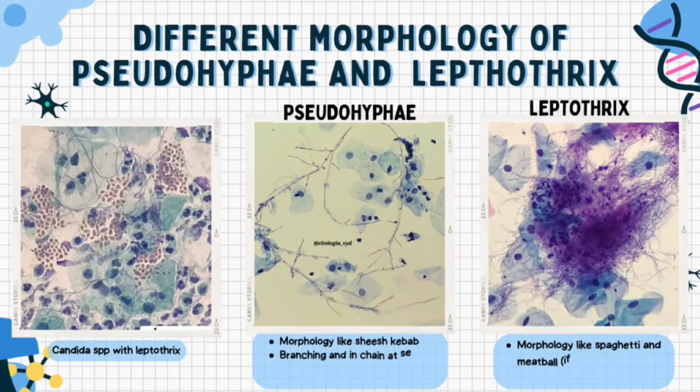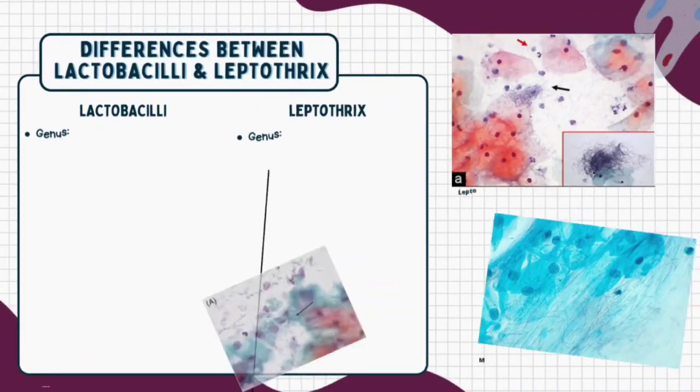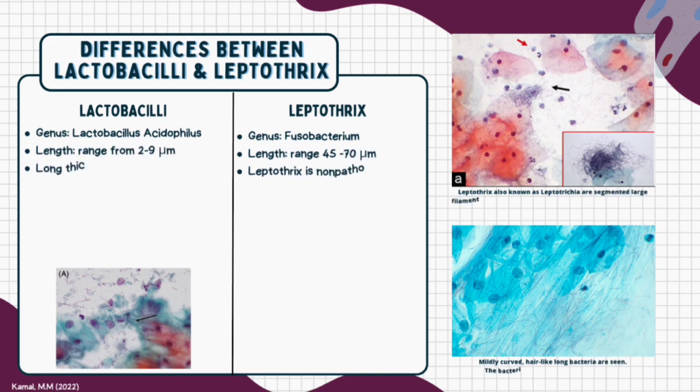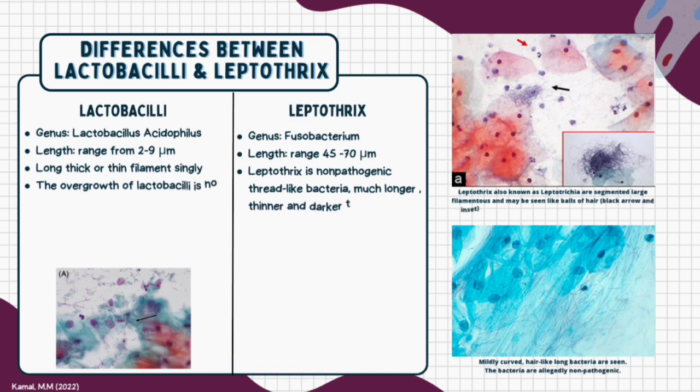Next, we go to the difference of morphology of pseudohyphae and Leptothrix. Next, differences between Lactobacilli and Leptothrix. Why do we need to differentiate between Lactobacilli and Leptothrix? It is because the characteristics and the morphology are quite the same.